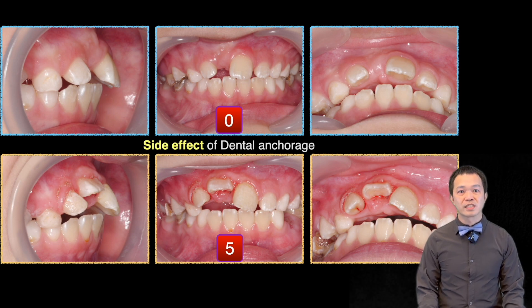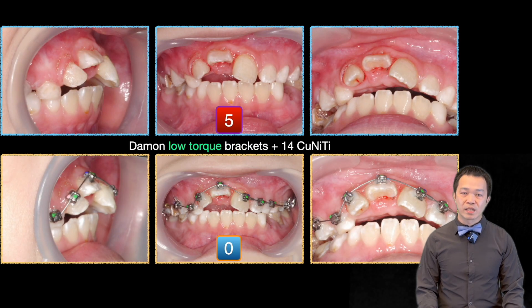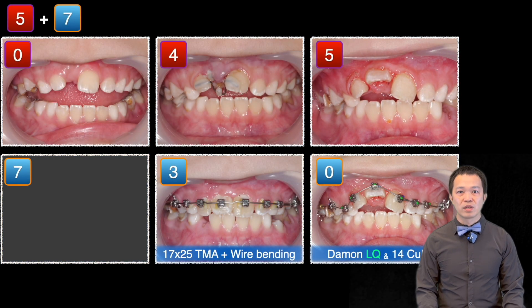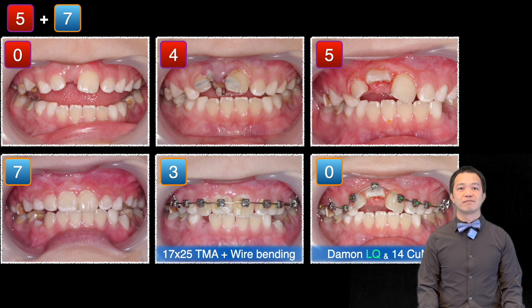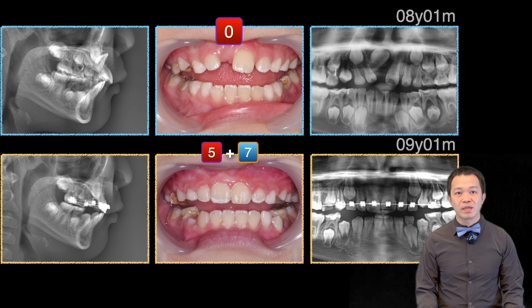But do you notice the side effects? Using dental anchorage, especially with only two teeth, caused the anchorage teeth to flare out and intrude quite a lot. To finish alignment, I switched to Damon low-torque braces. It took only three months to align the teeth and seven months to remove the braces. In total, this case took about 12 months for surgery, traction, and alignment.